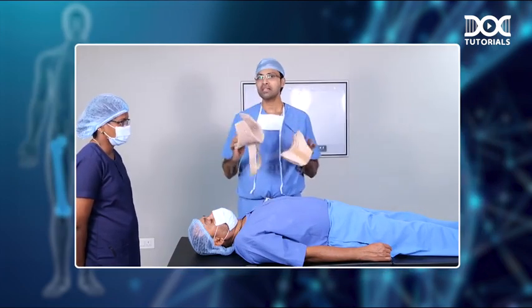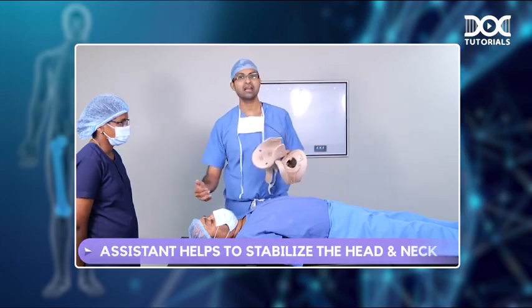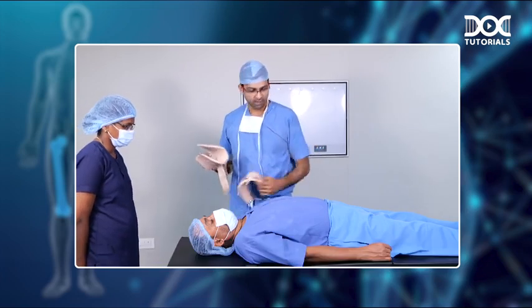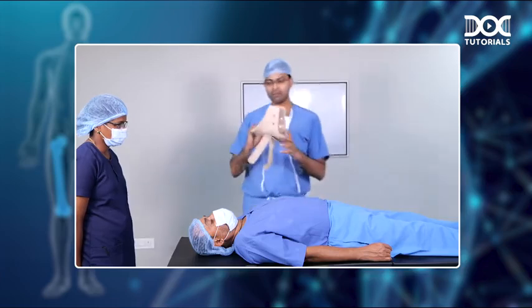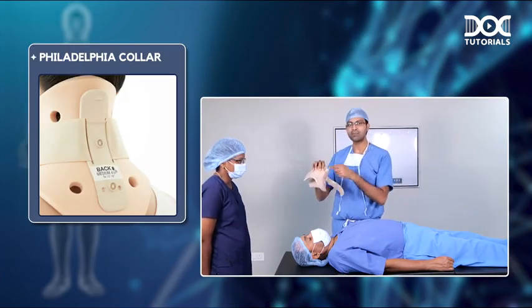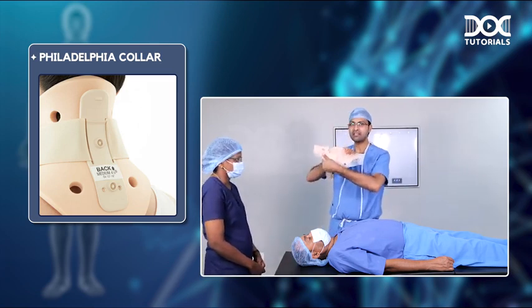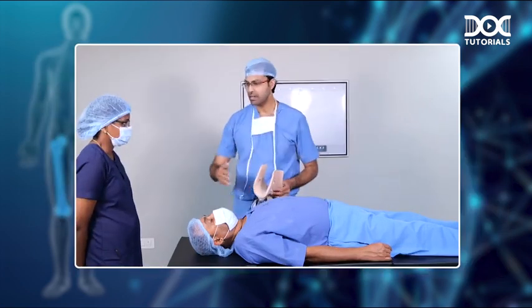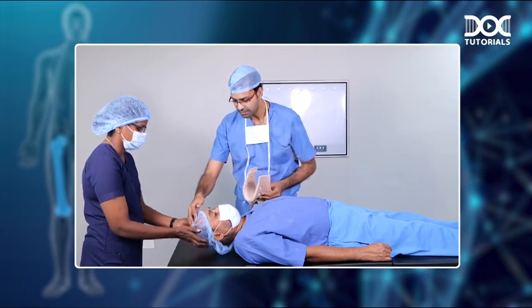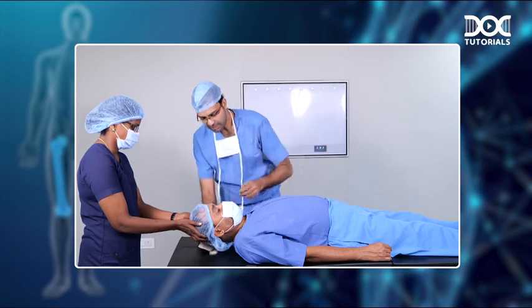See, whenever you are putting a Philadelphia collar, you need an assistant with you who is going to stabilize the head and neck for you while you are putting the collar. Okay. So, first thing that we do is to apply the back part. So, you always look for the directions that is given here, which is up and which is low. So, first thing I do is that I'll flatten the collar like this. You ask the assistant to hold the head and gently lift the head up, stabilizing the neck. Now you slide the cervical collar underneath like this.